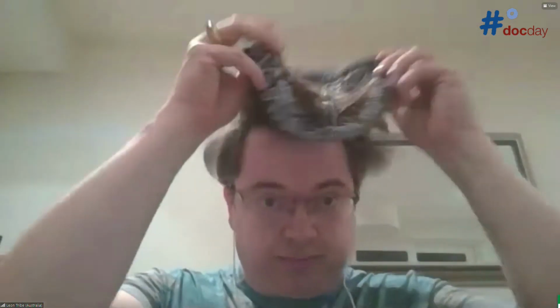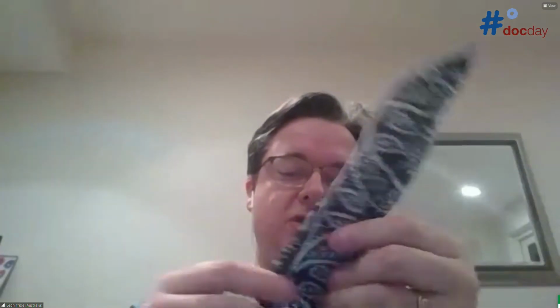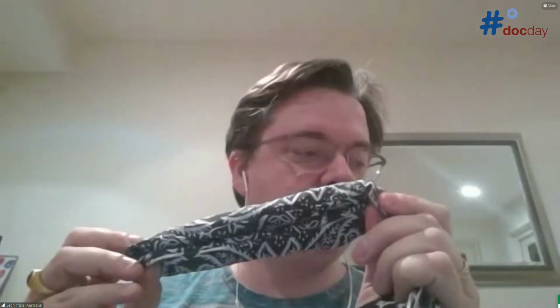And what you do is literally you get 2 of them, and if you do a stitch down each side and then turn it inside out, you get this. This is actually an insulin cooling device. It's not a headscarf. And so what you then can do is you can get your insulin pens. These are the ones I carry when I travel, and you can fit them inside. 2 minutes. Okay. And then you just tie it off at the end, and then you've got it, right? You've got an insulin carrying device. And again, this works just like the Frio. You can soak it for 5 minutes and it just works.